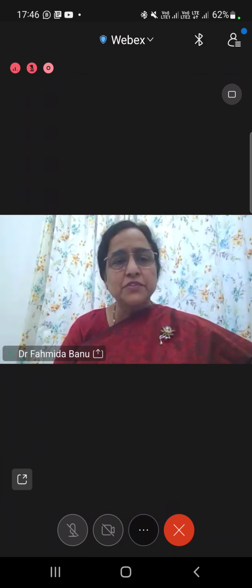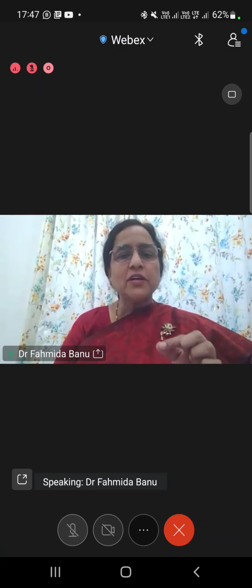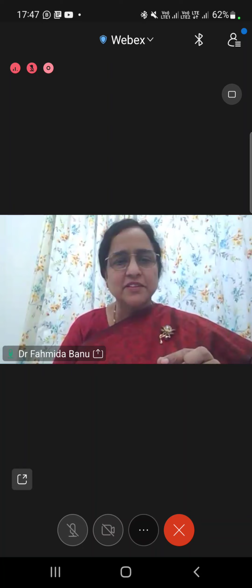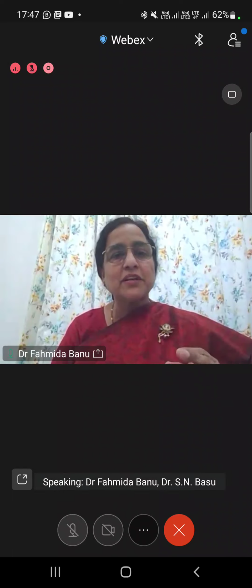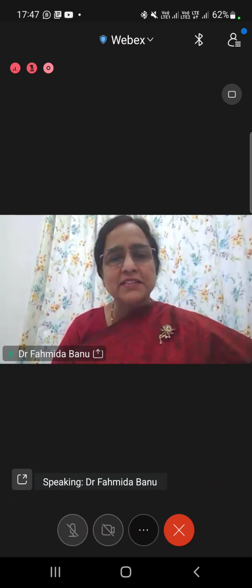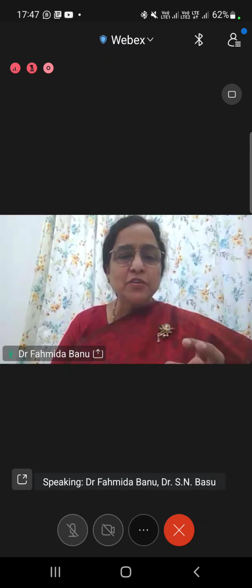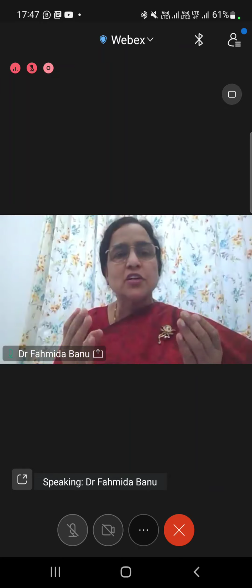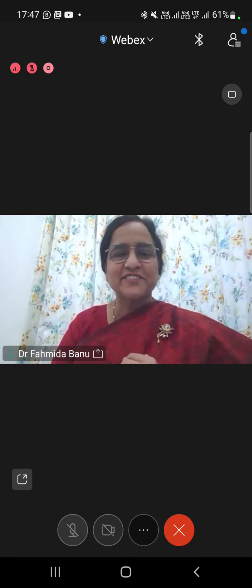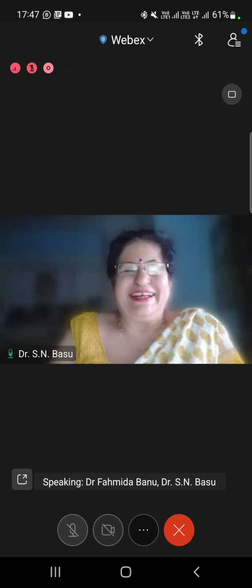Yes. One more beautiful point of hysteroscopy is when you are almost coming out, stay back for a few minutes, look at the squamocolumnar junction. You feel as if you are diving under the sea and seeing the underwater beauty. The columnar epithelium will be moving like the sea anemone. It is really beautiful, and you feel as if you are doing a colposcopy. Because all the colposcopists will like to see the squamocolumnar junction. See the squamocolumnar junction through the hysteroscope and you enjoy it. True. Very true. The pleasures of doing procedures at times.